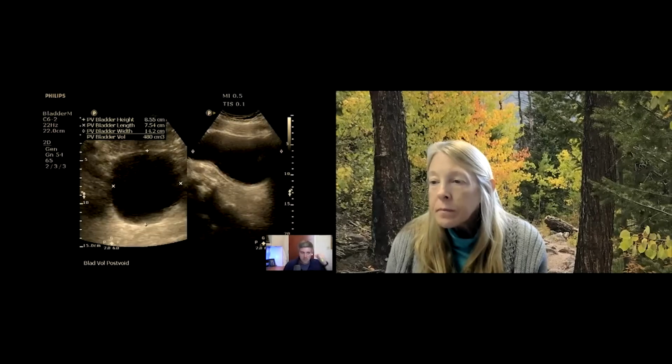So if we take that still image, this is a different patient, obviously, but the same concept. On the left we have the transverse oriented image, and on the right we have the sagittal oriented image. I can measure basically inner wall to inner wall, because I want to measure the amount of urine that's in there. So inner wall to inner wall in the length, the height, and the width, and get those three different measurements. It goes into the calculator, and in this situation it spits out a bladder volume of 480 centimeters cubed, or 480 milliliters, right?